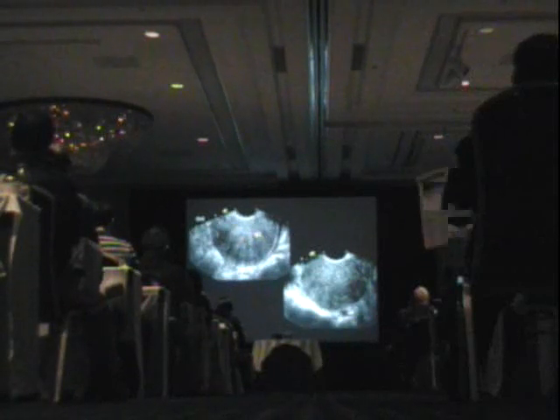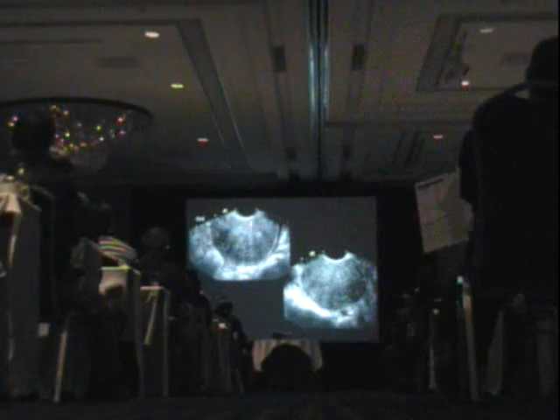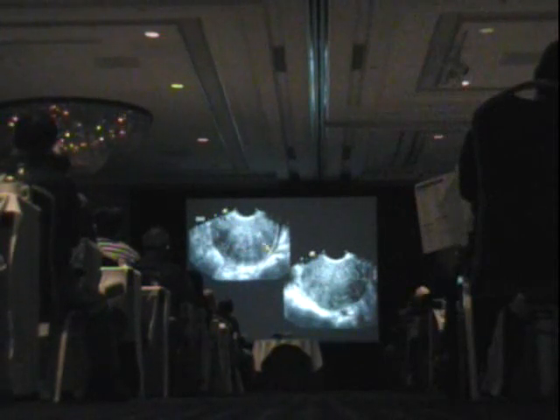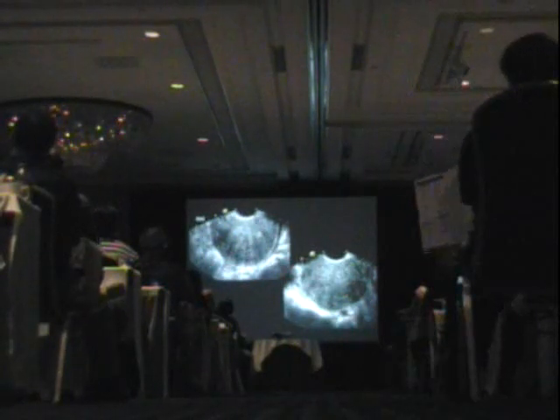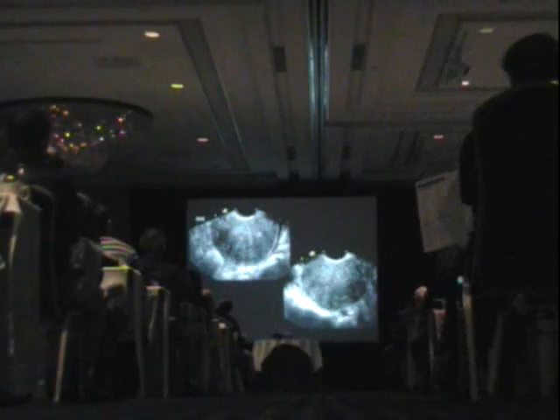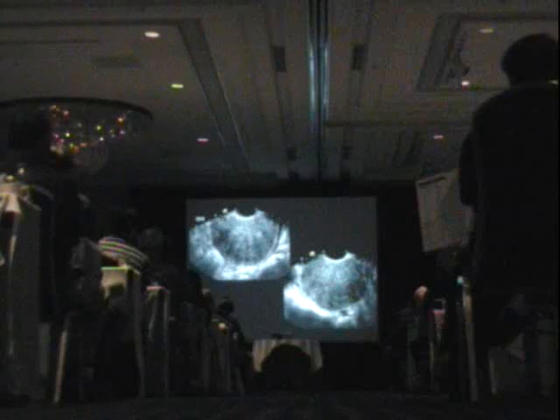On ultrasound, what we see is a thickened myometrium, particularly asymmetrically thickened. You see the endometrium here, and the posterior myometrium and the anterior myometrium are asymmetrically thickened. You do see those linear shadows, just like you saw off the fibroid, but there are no edges. There's nowhere to measure a fibroid. It's just all of the myometrium that's shadowing in that funny way and looking very heterogeneous. Also, when we look up a little closer, we can see tiny, tiny cysts in the myometrium, and this is characteristic for adenomyosis.